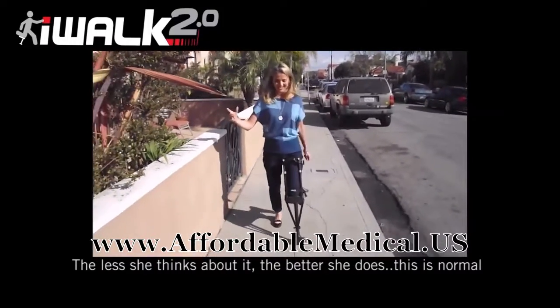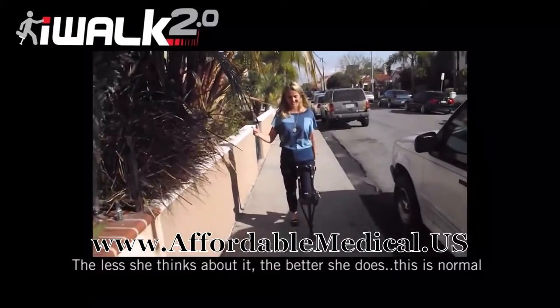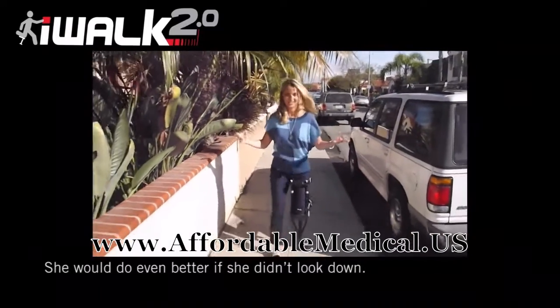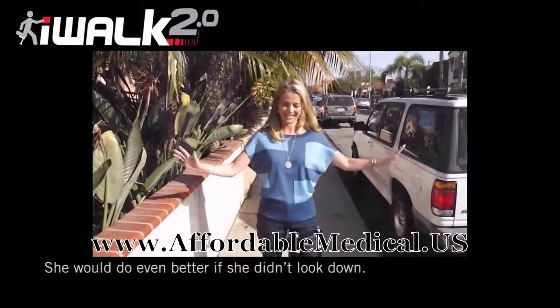My friends at work will be very excited. Coffee! I can see myself standing up at work doing a presentation. No problem. Yay, I'm good.